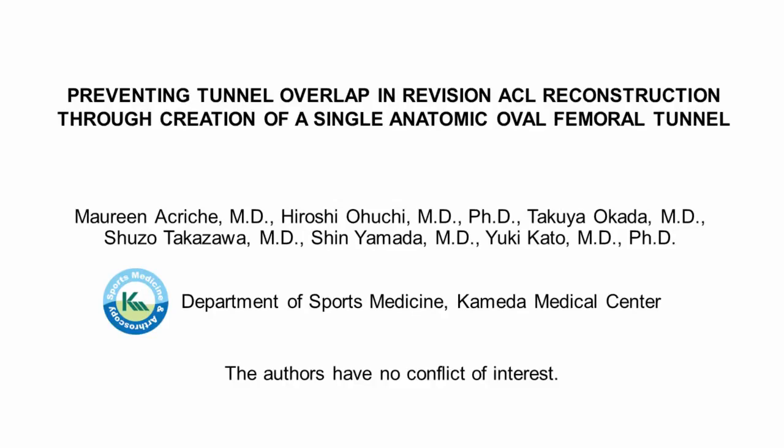This is a technique video on preventing tunnel overlap in revision ACL reconstruction through creation of a single anatomic oval femoral tunnel. To begin, the patient is positioned supine and sterile draping is performed. Standard anterolateral and anteromedial portals are made and diagnostic arthroscopy is performed.